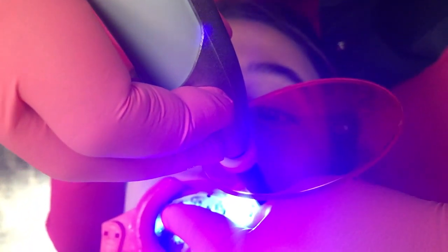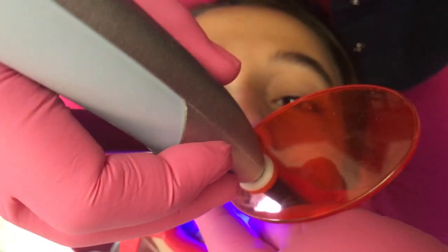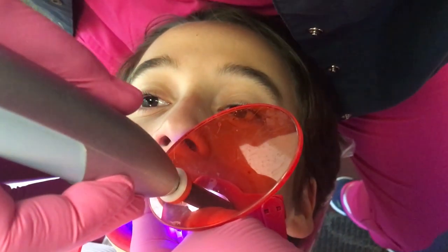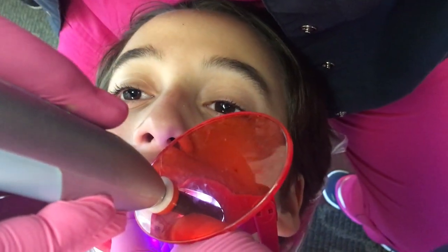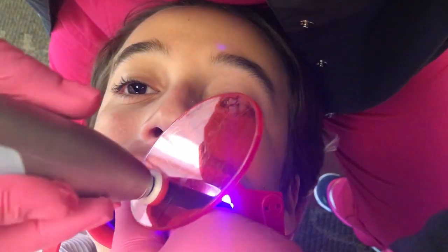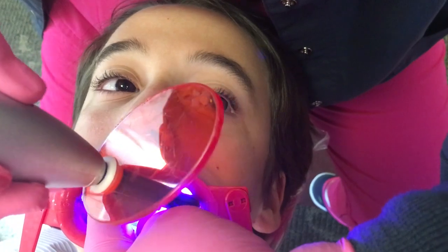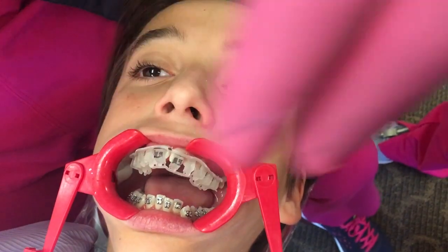Brilliant, but you kind of have to stretch with the light — the cheek — to see the 5 and 6. It's a little stretchy on the lip. Good job. When you're done with the light on the last tooth in there, then you release your fingers and then go gingivally. Release your fingers, light gingivally.